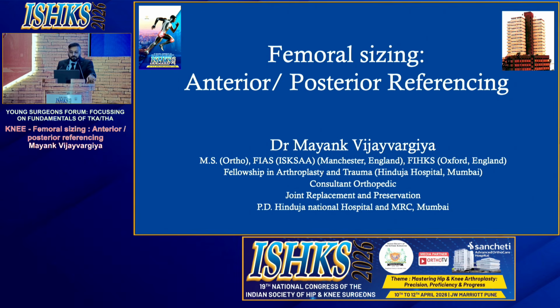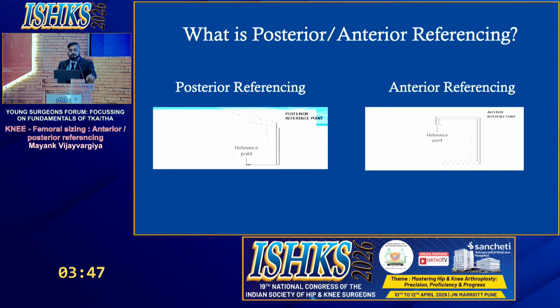We'll be discussing femoral sizing, anterior versus posterior referencing system in total knee arthroplasty. It is a simple but very important concept as it affects the gap balancing and the surgical outcomes. So what is referencing? Referencing essentially means which part of the femur do you keep constant while sizing the femur. There are two systems, anterior and posterior.